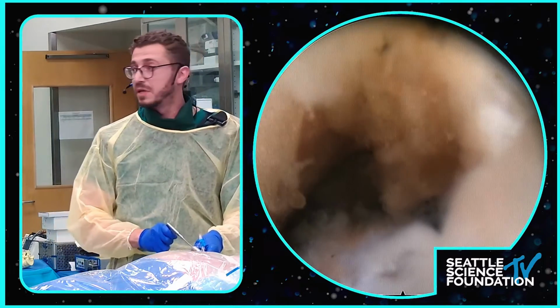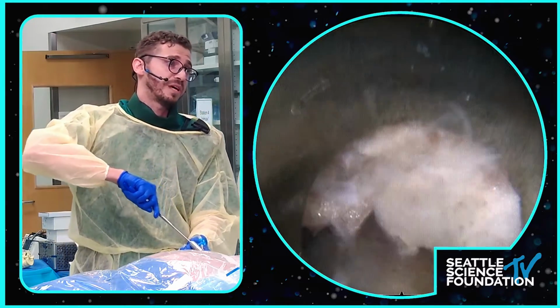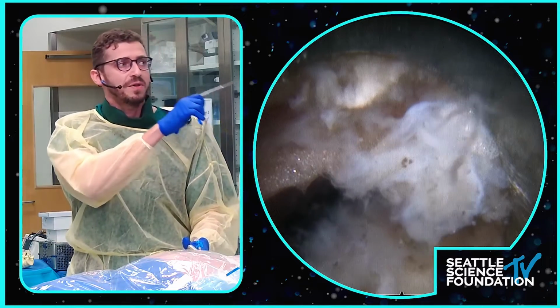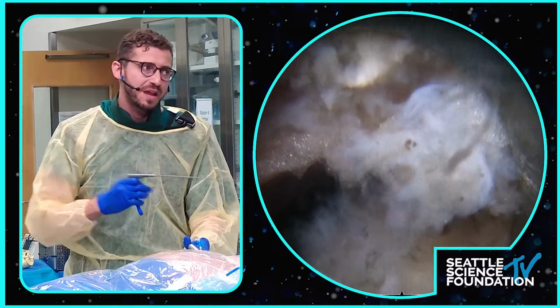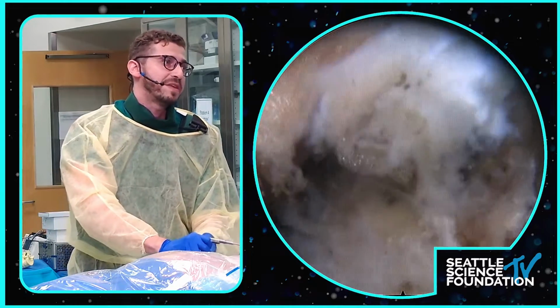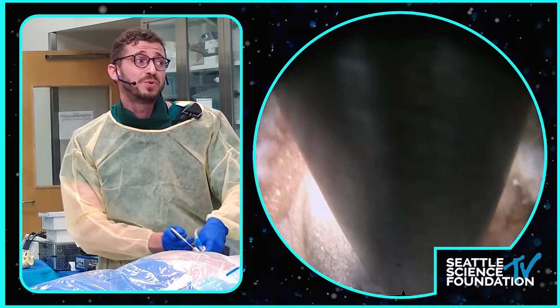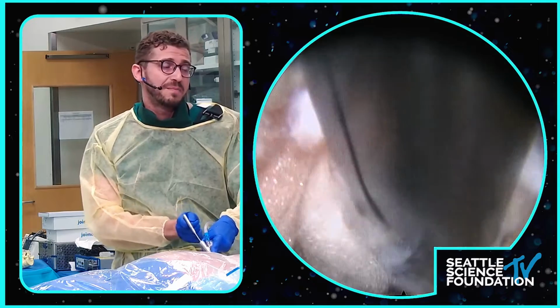Walk me through that. So yes, the exiting root is an additional step that's really hard. There are two ways of doing it. You could either follow the foraminal part of the ligament, which we took off here with the reaming, and if you follow that up, at the top of it, there's usually a little gap, and that's usually where the exiting root is. The second way, and the way that honestly I like to use more in this situation, is to follow the thecal sac all the way up, and then you know it's going to be in this area here. And you just have to take very small bites at a time. It's really hard sometimes in someone who has a very collapsed foramen. You have to do a lot of drilling to be able to get to that. So those are usually the two ways that at least I do.